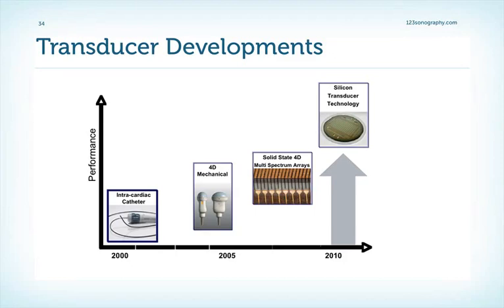We have seen incredible developments in transducer technology in the last 2 or 3 decades. We can not only put these transducers into transesophageal probes, but even into catheters and perform intracardiac ultrasound. We're now also able to use 4D imaging technologies where we don't only image a sector, but a whole pyramidal volume. We can even perform what we call live 3D imaging. I am sure that this is not the end of the story. And on the horizon, we can see a completely new transducer technology evolving, the so-called silicon transducer technology.